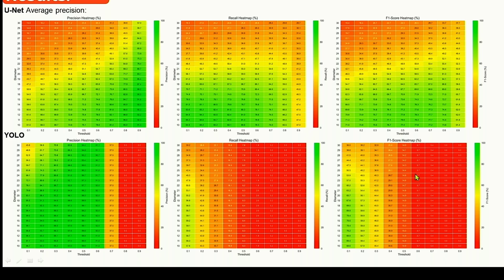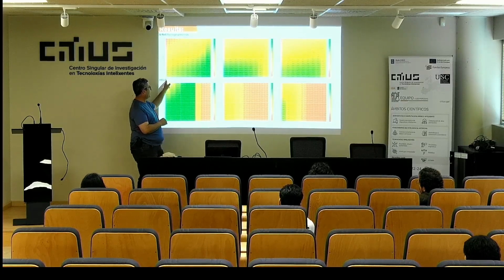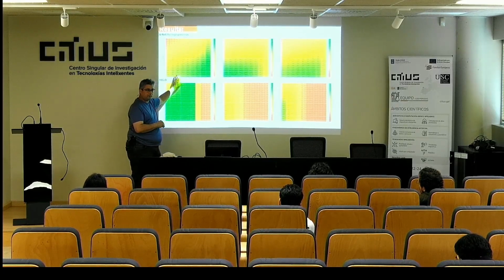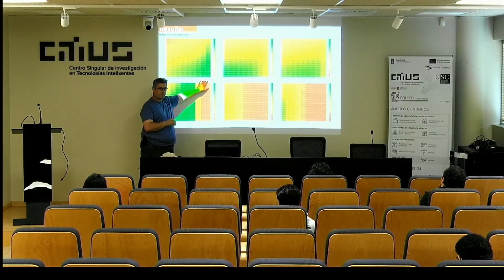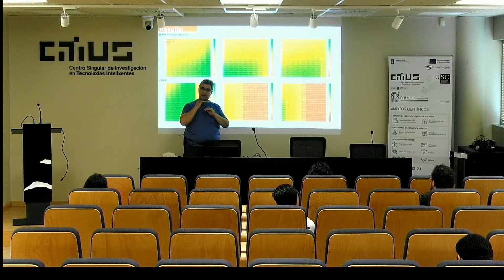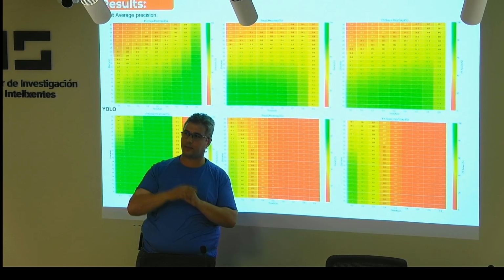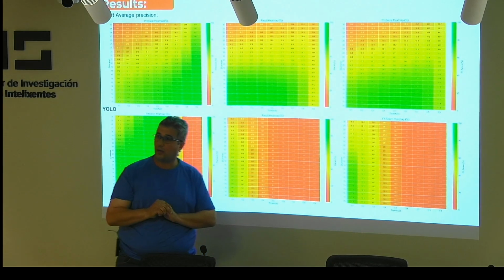Okay, now we show our results, starting with the heat map. Before explaining the heat map, I want to show you there's a threshold between 0.1 and 0.9, which represents the value. Any cell that exceeds this threshold means a predicted cell, or a good cell.